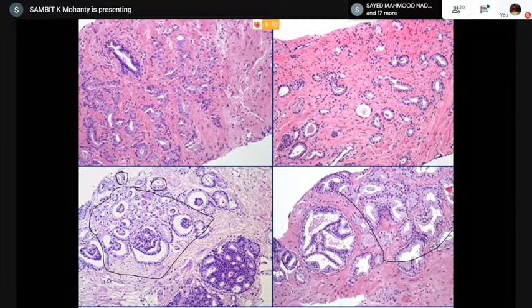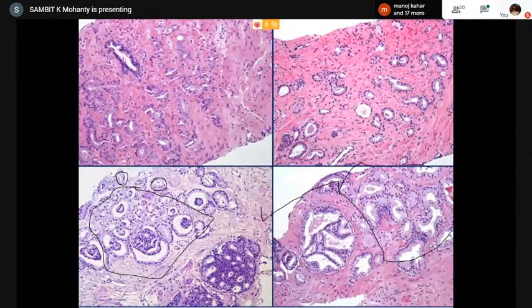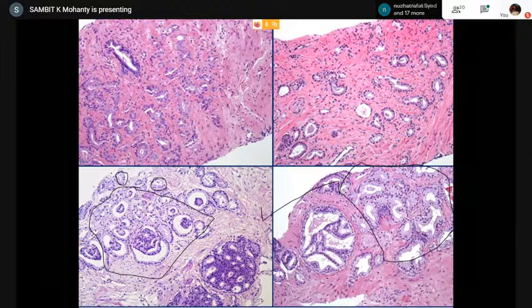You can use a pointer and point out. Sorry. This area, within the circle. 3 or 4? Arpita says 4 from YouTube. Yes, it's 4. Because on the right, yeah, this is all 4.